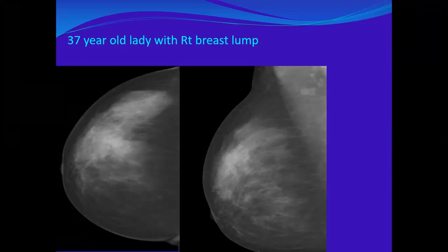There are multiple lymph nodes. I couldn't identify the hilum within these nodes. For me, they are suspicious. Who is talking? Sarah? Sarah, okay. Axillary lymph nodes are one of the associated features. Since you said no associated features, and then again you said there is associated adenopathy, there is a contradiction here, okay? But lymph nodes are considered one of the associated features. So it will be focal asymmetry with no associated calcification, but there is associated lymphadenopathy.